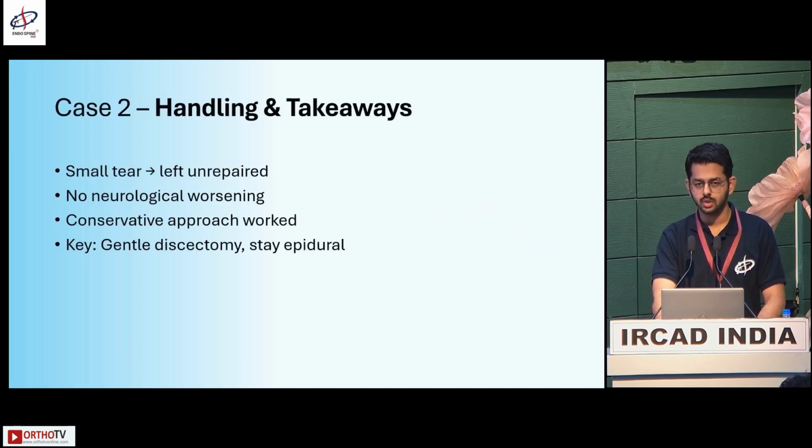Dural tears often happen due to blind or forceful discectomy. Always decompress gently, especially when adhesions are expected. Adequate foraminoplasty early in the case gives you space to work safely. Avoid traction or deep midline dissection and stay within the epidural zone.